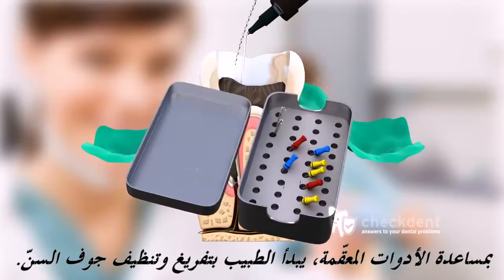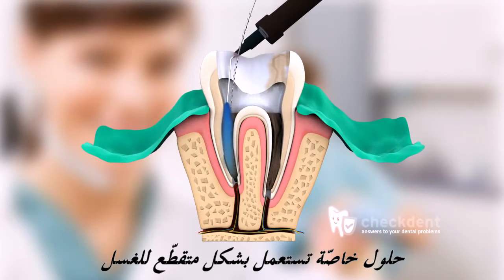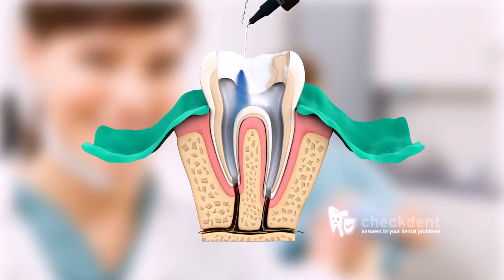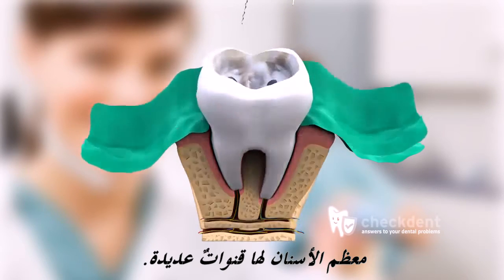With the aid of sterile instruments, the dentist begins to clear and clean the interior of the tooth. Special solutions are used intermittently for irrigation in order to flush out tooth chips, cell debris, and bacteria. It's important that all canals are reconditioned. Most teeth have several canals.